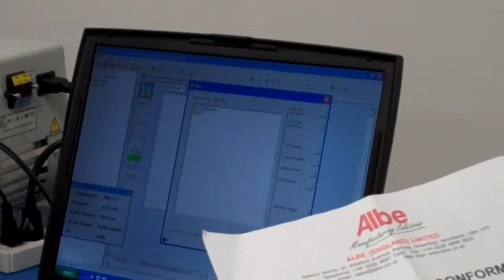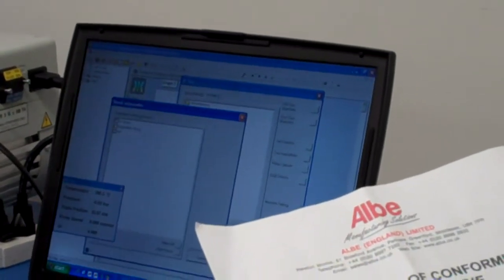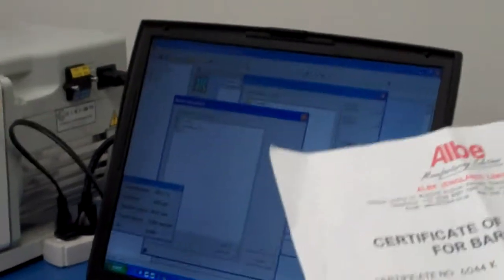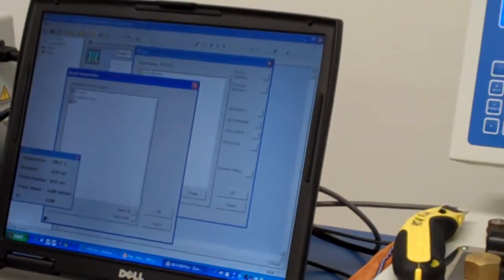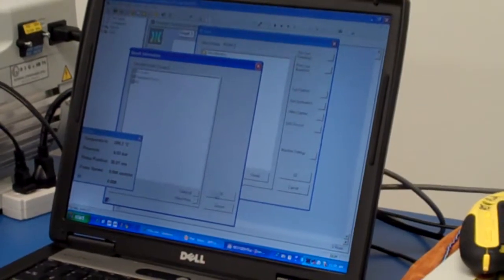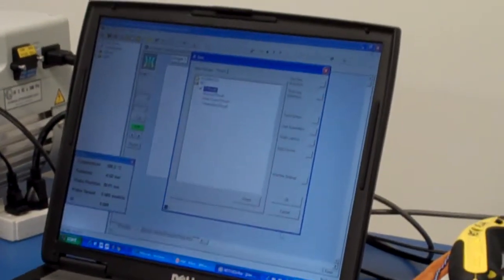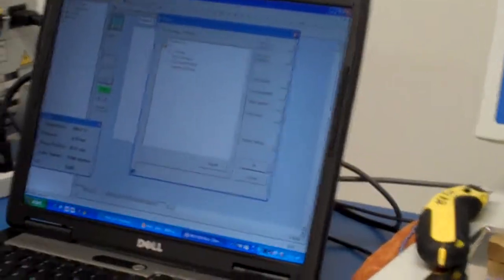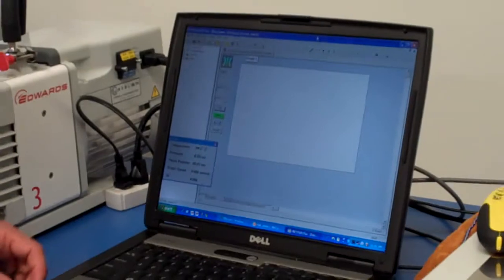In the results, we've got PT results. We've got IV results. IV at zero is the end result. We saw earlier in the presentation we extrapolate back to zero time. That's the melt viscosity, which some people are interested in. And that's the degradation, which again, some people are interested in. And that's all we need to do. It's really easy.